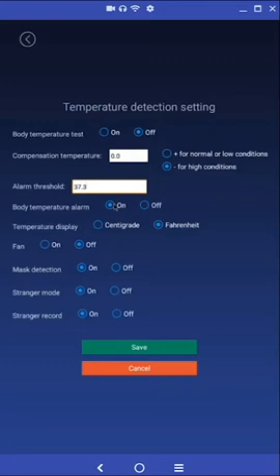Temperature display allows the displayed temperature upon check-in to be in Celsius or Fahrenheit. There is a fan located at the top of the device, located in the rear of the head unit. Changing the fan setting to on will turn on this fan. This will provide cooling to the unit, which may be needed in environments that have limited access to climate control.